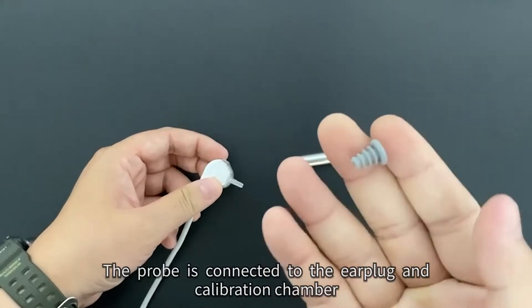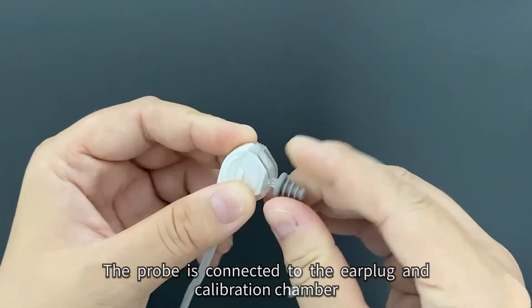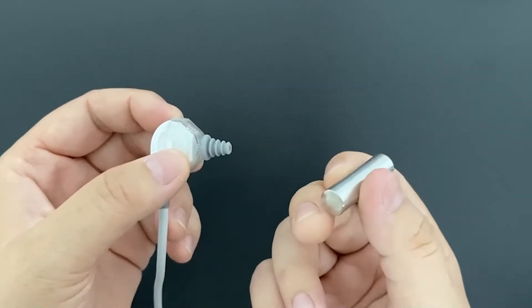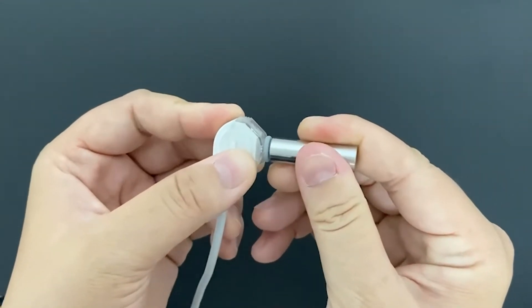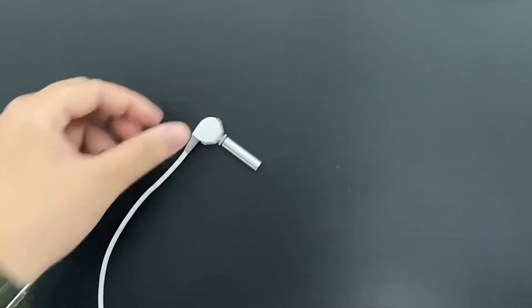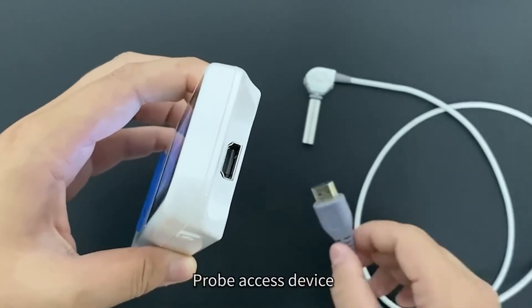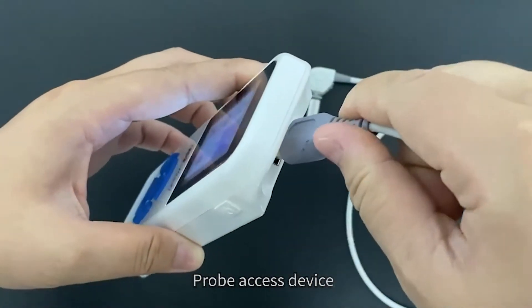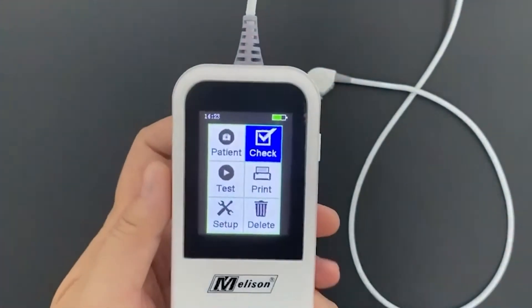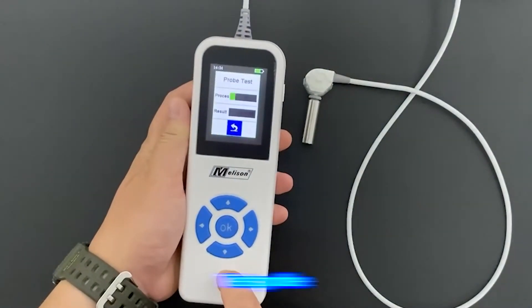Connect the probe to the earplug and calibration chamber. Access the device with the probe, then select checking and select test probe.